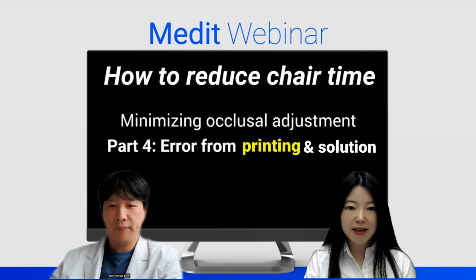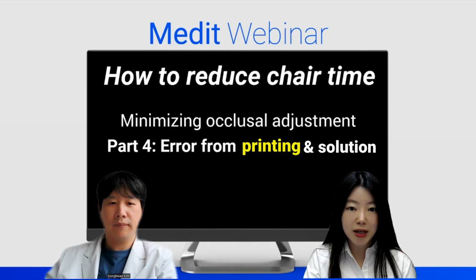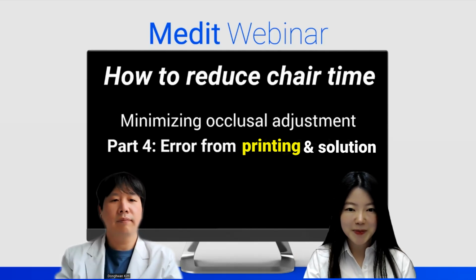I can feel your eagerness to learn more about digital dentistry with Medit. I'm sure Dr. Kim will give us another useful and interesting lecture for today's webinar, right?